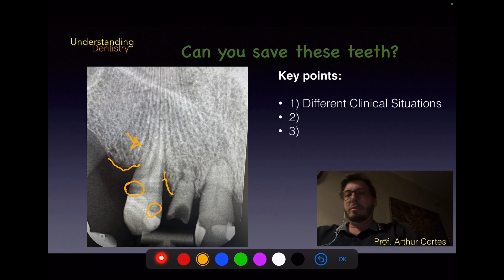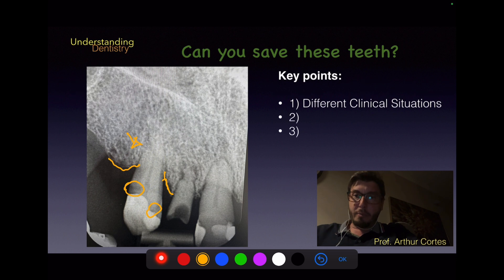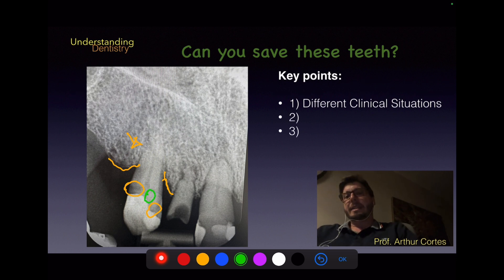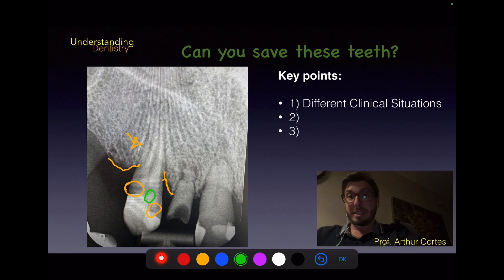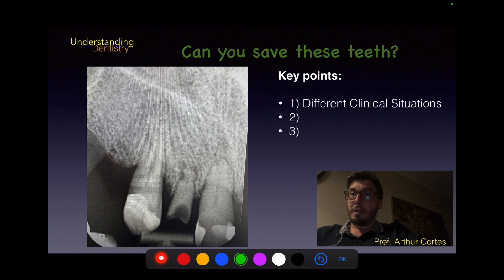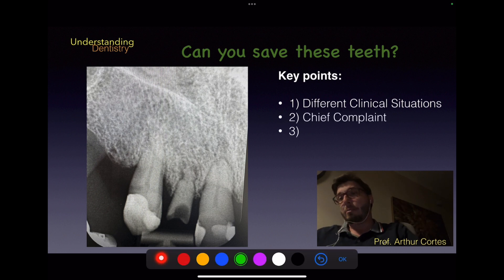Below the restoration on the canine, the radiolucency or radiopacity differs from the rest of the dentine. Comparing with normal dentine radiopacity, we could interpret this as a different radiolucent aspect of the dentine. Remember, radiographs should only be interpreted after a full clinical examination and review of the patient's history.